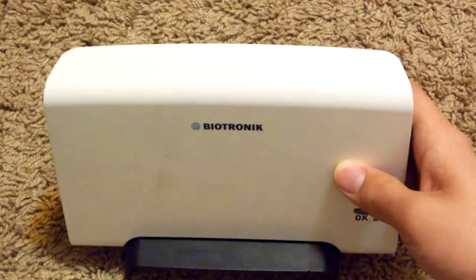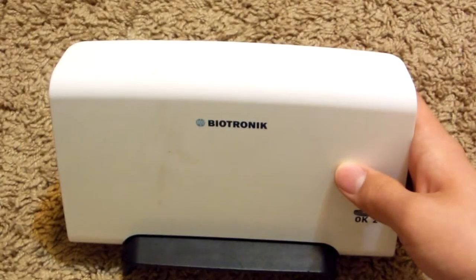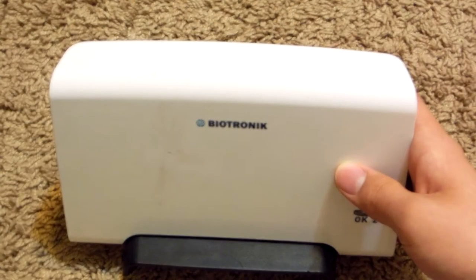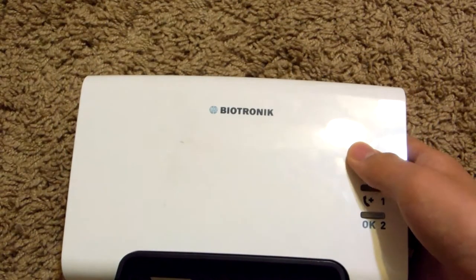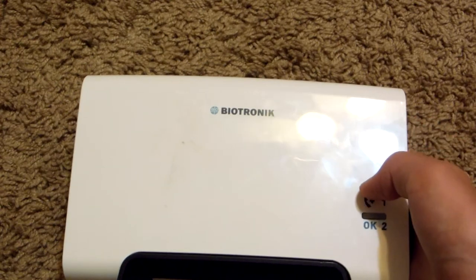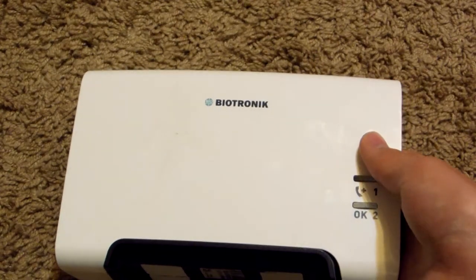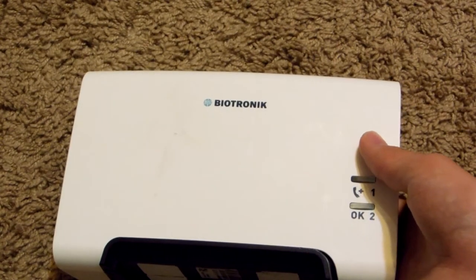Now this thing no longer works. I actually found it at a local thrift shop for only about 50 cents. It may not have that much in it, but it's really an interesting thing to be able to take apart.